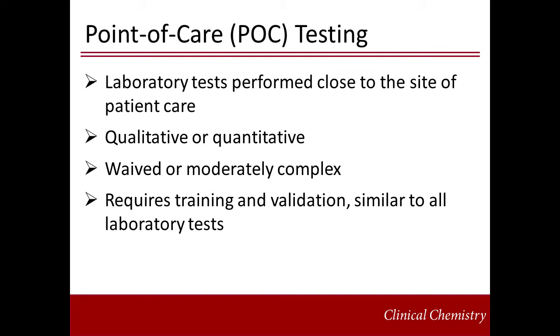Although both waived and moderately complex tests require validation and training, it is important to know which CAP guidelines are necessary to follow for a particular device. Since the CAP is specific to the United States, if you're watching this from an alternative location, it's important to be aware of the specific regulatory parameters adopted by the government agencies specific to your country.